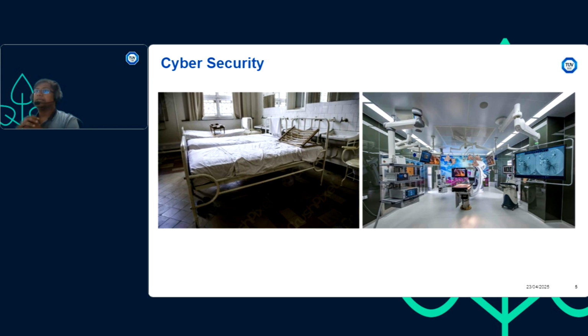Obviously, these things catch our attention and also the attackers' attention. Now this particular connectivity and all the interfaces of this application bring their own challenges. Previously, the only way to get the data was physical. You needed to physically break into the hospital. Then also, if you're lucky, they were storing data as digital copies or CD-ROMs, then only you could steal it, else it was only paper. But nowadays, you can get this data sitting thousands of miles away. And that's where we started looking for cybersecurity in medical devices.